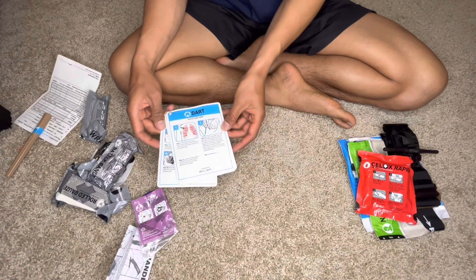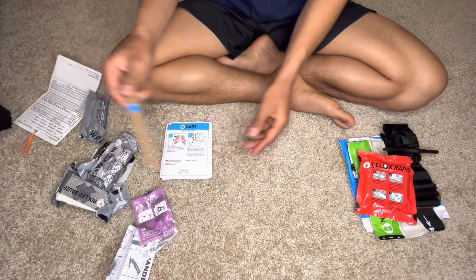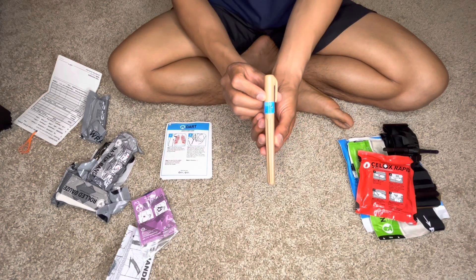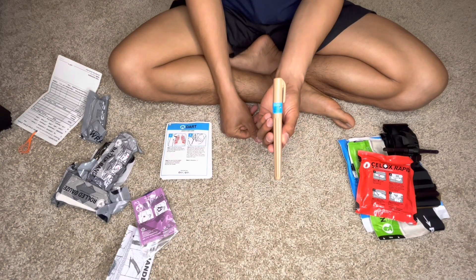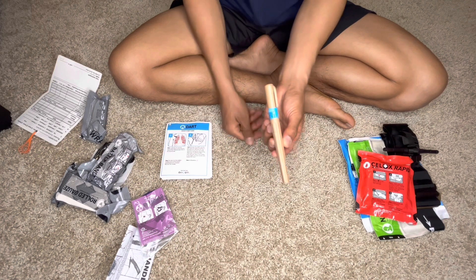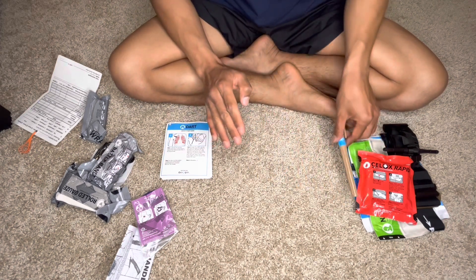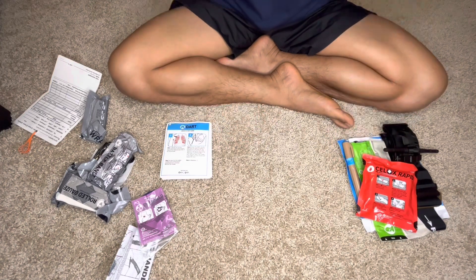The next one will be the dart, or what we call the NCD — needle chest decompression. I won't open it because these are all sterile and I don't want to contaminate it, as I will be the one using it.